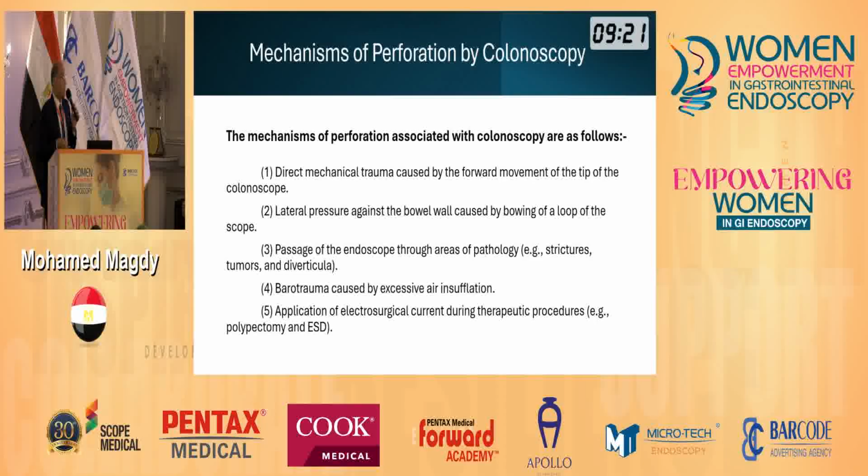The problem here is that sometimes the perforation does not appear at the time of colonoscopy and can appear later on, one or two days after, as the electrosurgical current causes necrosis of the tissue, followed by perforation. So be careful, even when you do a polypectomy, sometimes perforation occurs later on.